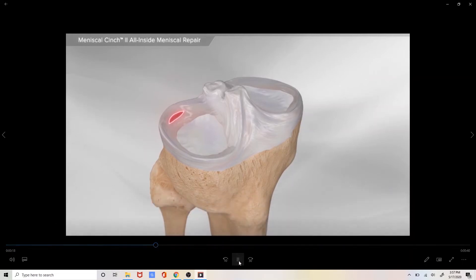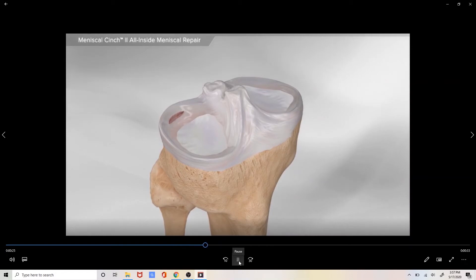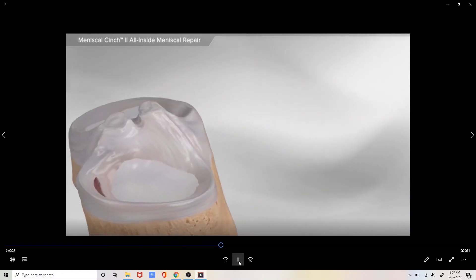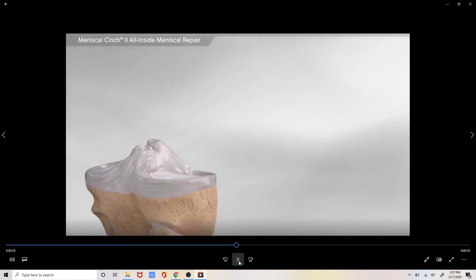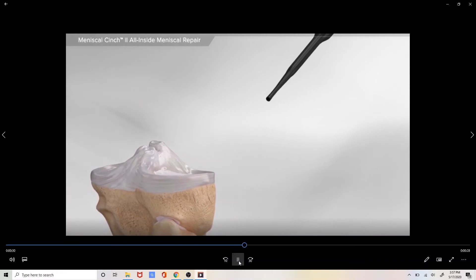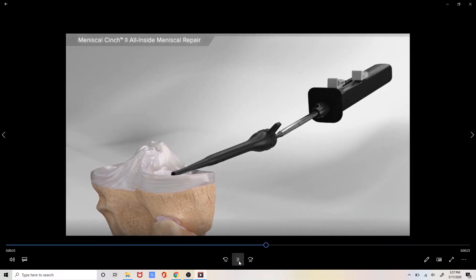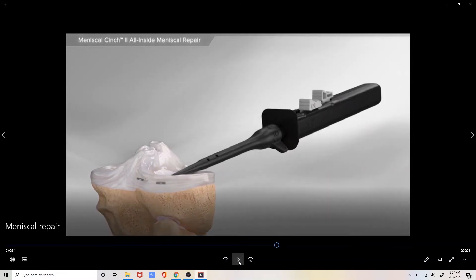We will come in with an all inside arthroscopic meniscus repair device. When we look at it from the back the meniscal repair device will come in through a poke hole in the skin in the front of the knee.